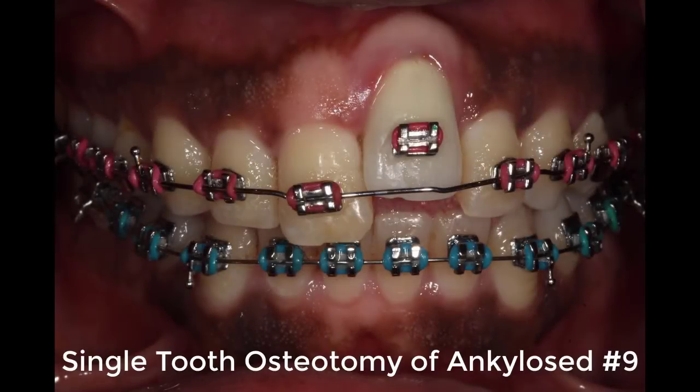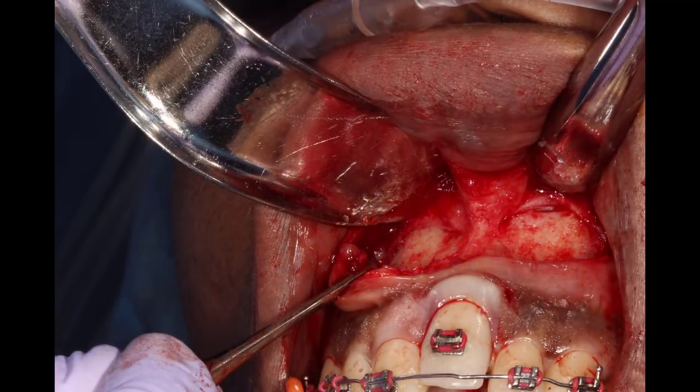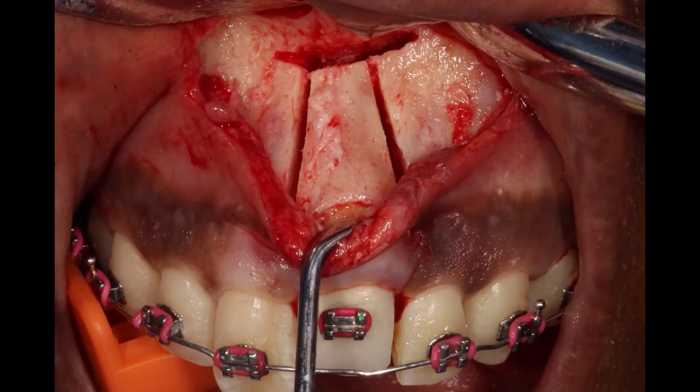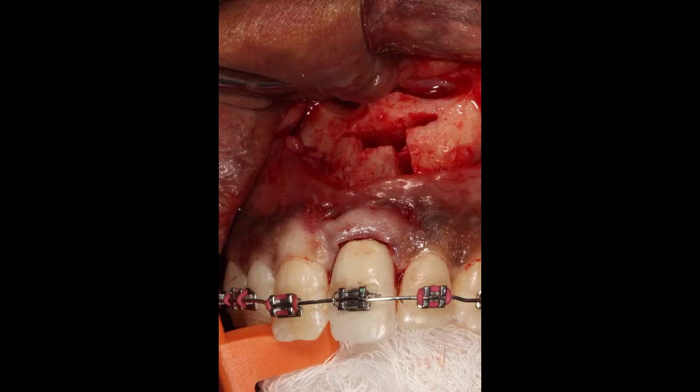Here's a case of a single tooth that was ankylosed, had been endodontically treated, and the prosthodontic department wanted it to be coronally repositioned and placed in the arch wire. We used the Piezotome Cube by Acteon to perform the osteotomies all the way through from buccal to palatal, maintaining the palatal mucosa as the blood supply to this segment. We then coronally repositioned it, placed the bracket in the arch wire for stability, performed grafting around the osteotomy site, closed it, and stabilized it for healing.